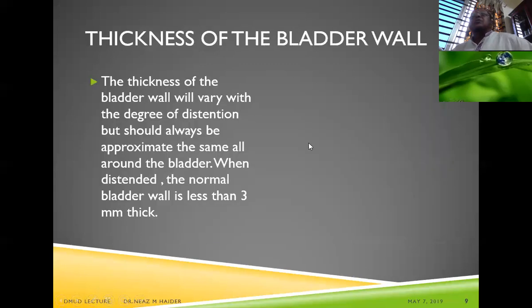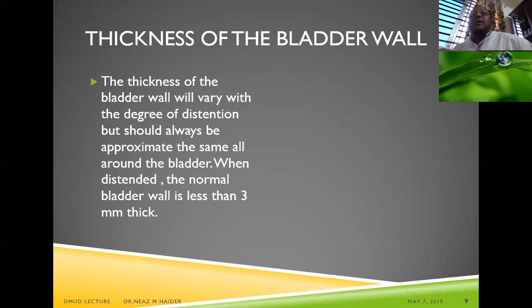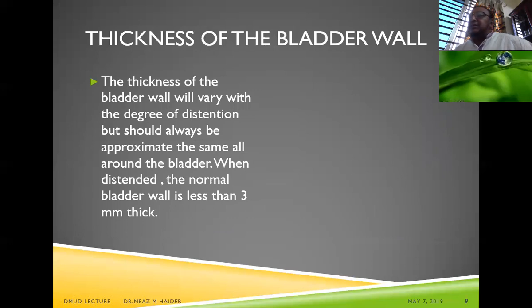The thickness of the bladder wall varies with the degree of distension but should always be approximately the same all around the bladder. A normal bladder wall is less than 3 mm in thickness.